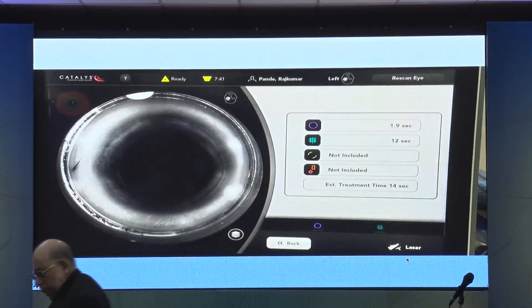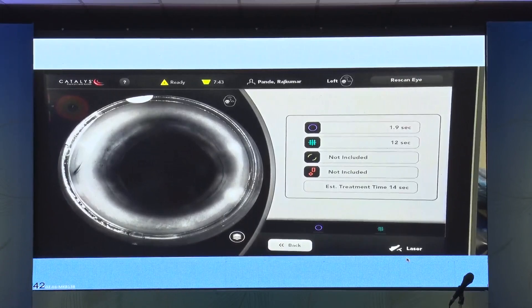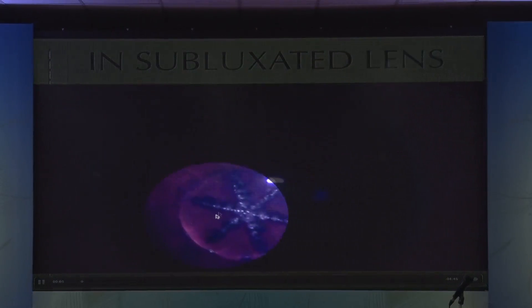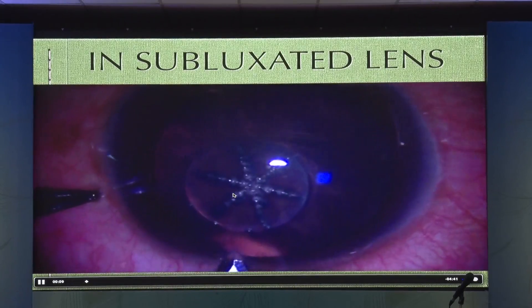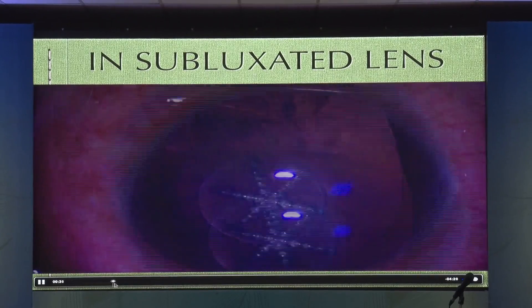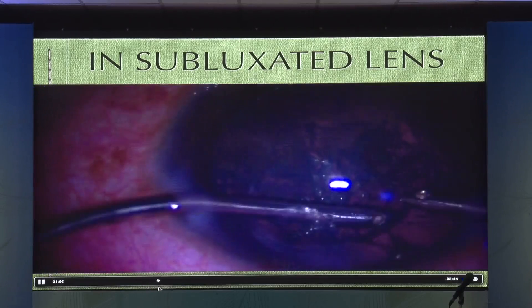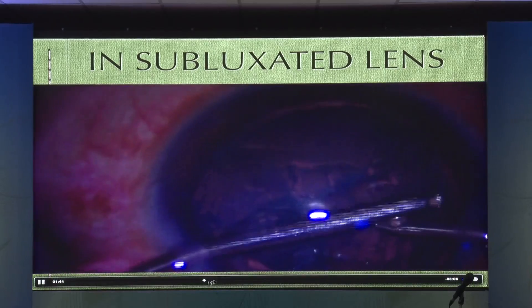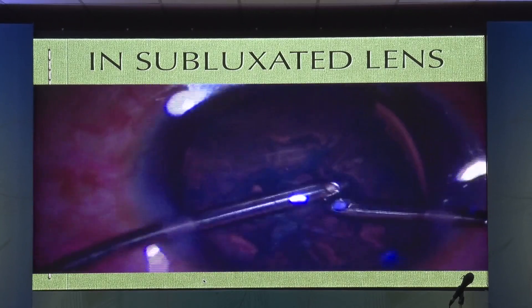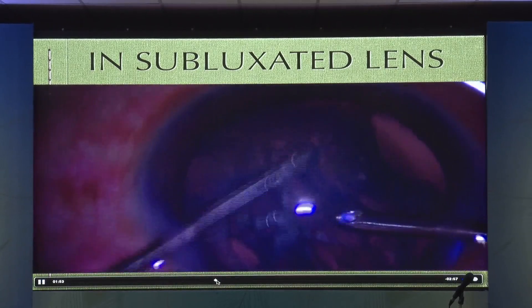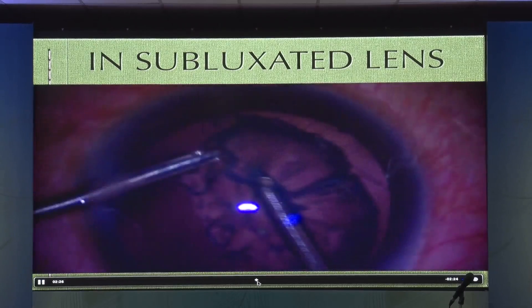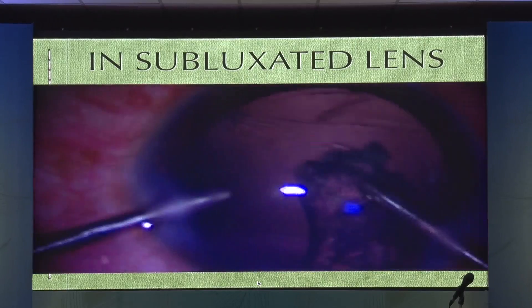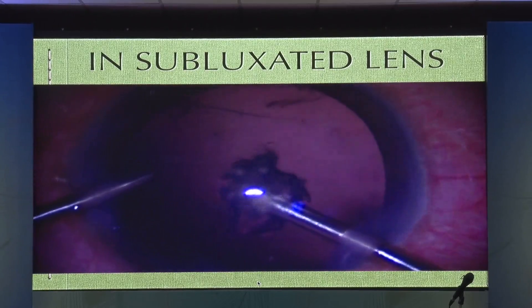Let's see this case clinically as to what it looks like during surgery. It's a small CCC of 3.9 millimeters. Little bit of fragmentation happened — as mentioned, it was a young chap. I made the incision and decided to go ahead and do a bimanual IA directly. I want you to see how the posterior capsule behaves during bimanual IA — it tries to follow your aspiration port, obviously because of the inferior subluxation. With a slow, gradual procedure it can be easily removed.